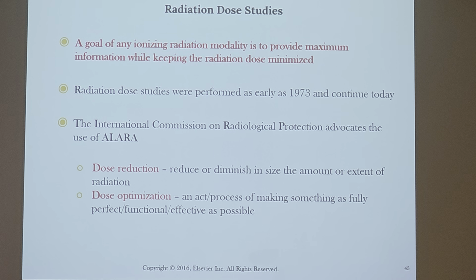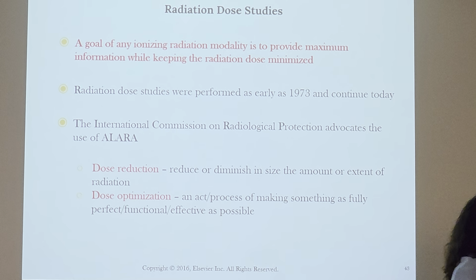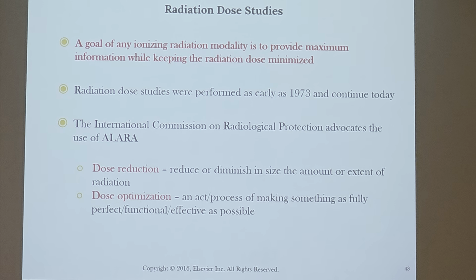All right. Again, the science, the physics, we're going to get to it step by step. Again, this is just an overview. Radiation dose studies, we know that we're talking about a high source of X-ray in order to get all that volume of imaging, and it's repeating itself. So it's dose, dose, dose. However, we're making some great strides. Way better than 1973, right? Where people were getting radiation sickness, and we started to see cases with pediatrics and leukemia. There's correlation. So case studies, trial and error, is basically giving us our evidence base to say, hey, we need to have better practices in radiation.